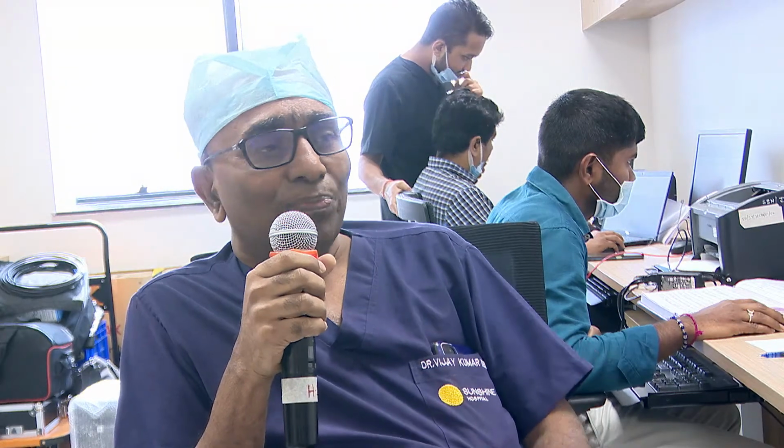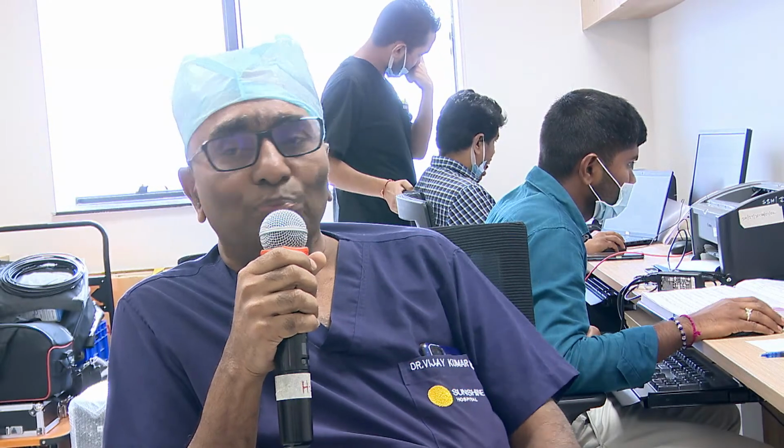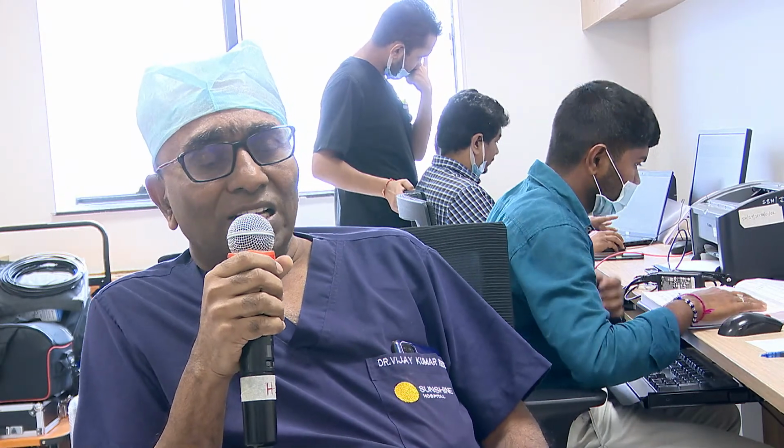OCT has given good results. The stent used was 3.5 by 38, and it was post dilated with a 4 NC, nominally distally and up to 12 atmospheres proximally. So the post OCT run shows there are no edge dissections, there is no malapposition, and the stent is well expanded. So this indicates especially in a long segment, bifurcation and calcific lesions, the role of imaging to achieve optimal results is good. A nicely done case.